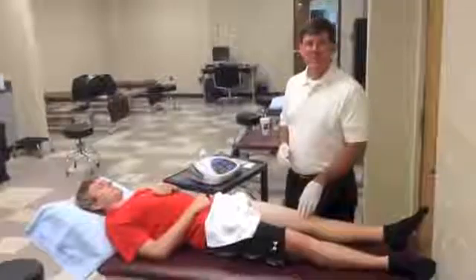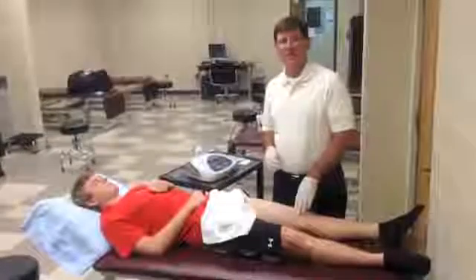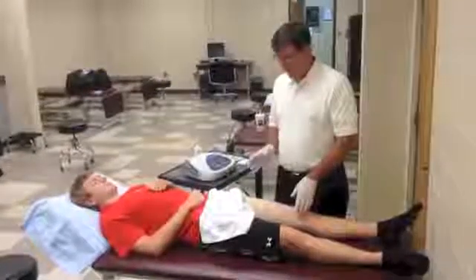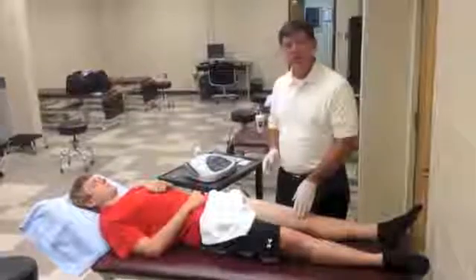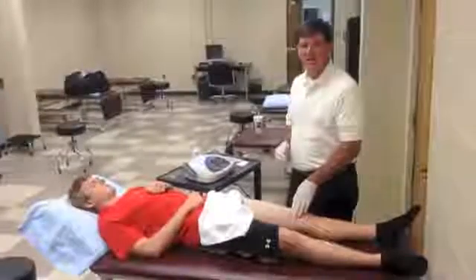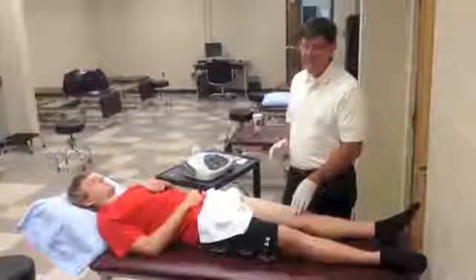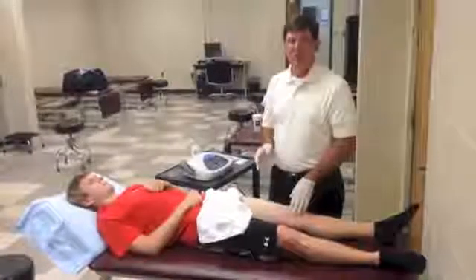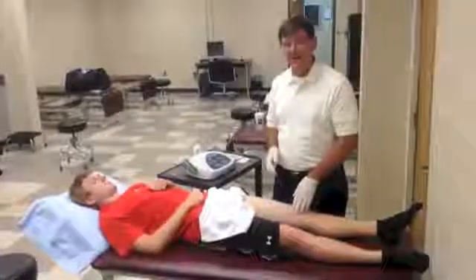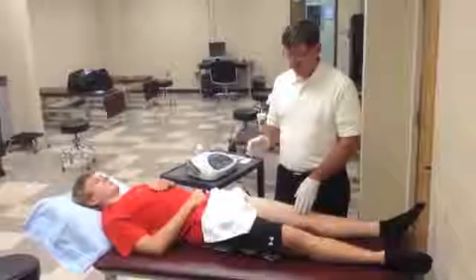Good morning. I'm Stephen Guffey and I'm associate professor of physical therapy at Arkansas State University. I wanted to demonstrate a treatment for you today using deep tissue oscillation. This is a technique that's really quite good for a number of musculoskeletal applications, from acute to chronic situations.